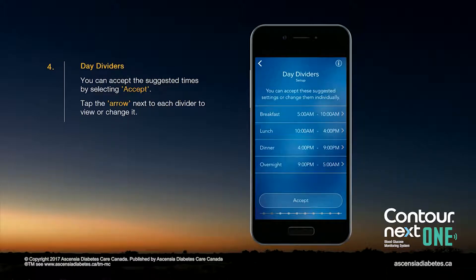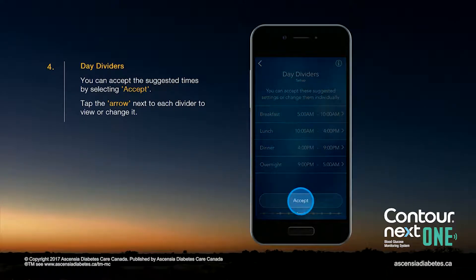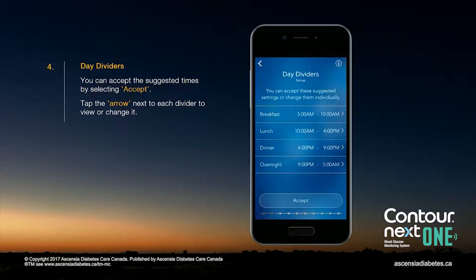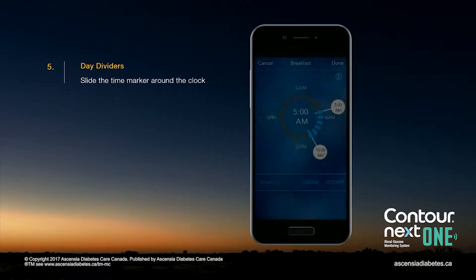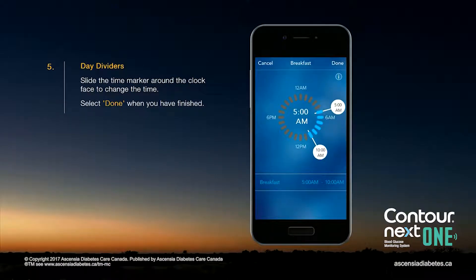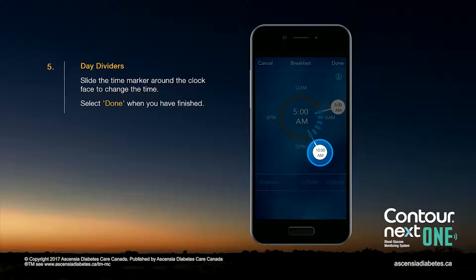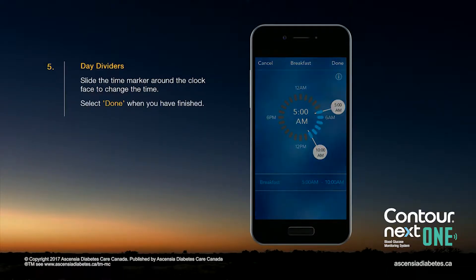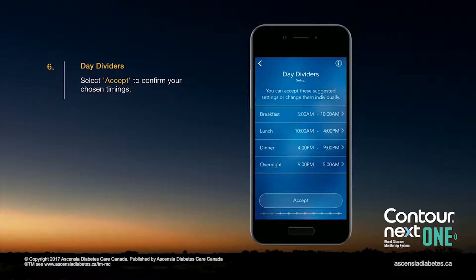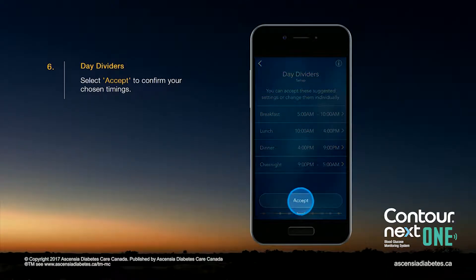You can accept the suggested times by selecting Accept, or tap the arrow next to each divider to view or change it. Slide the time marker around the clock face to change the time. Select Done when you have finished. Select Accept to confirm your chosen timings.